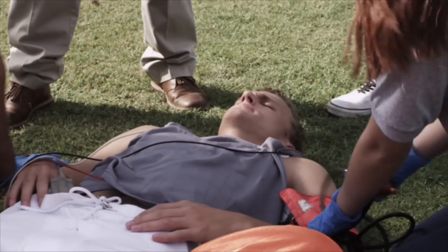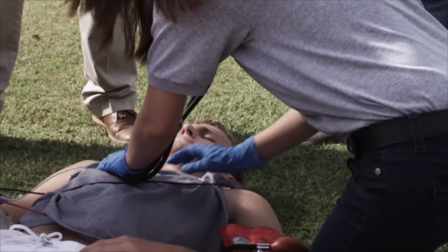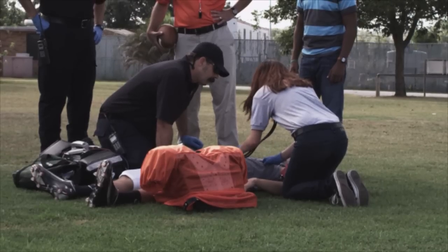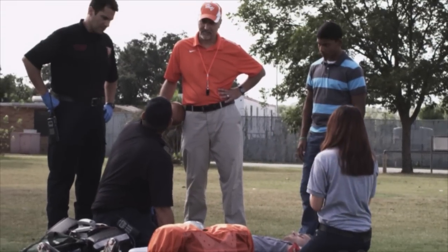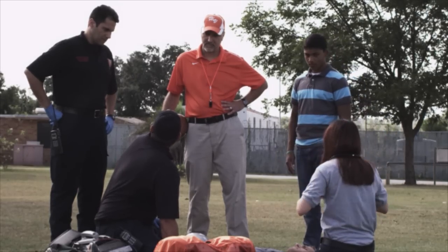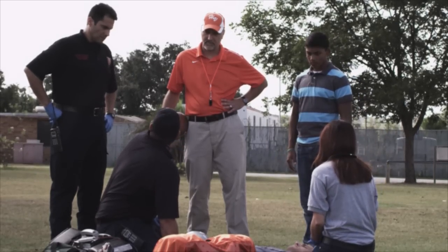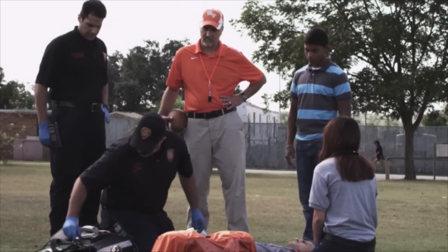All right, what did we get on the blood pressure? 77 over 38. All right, you want to go ahead and give me some breath sounds? Lung sounds clear? Clear. All right. We have a patient who is hypotensive at 77 over 38, pulse of 135, oxygen saturation about 96. Lung sounds are clear. I think this would be a good candidate for the ResQGARD. Awesome. Let's try that.